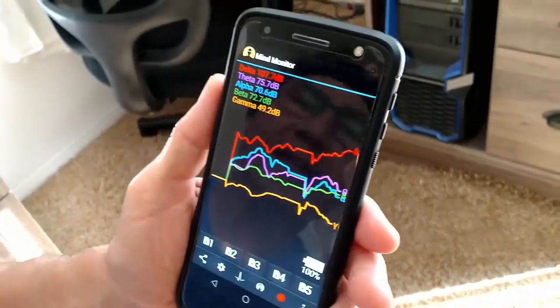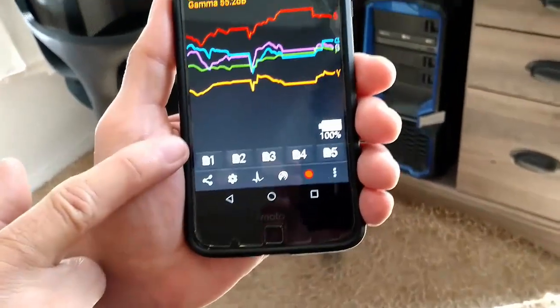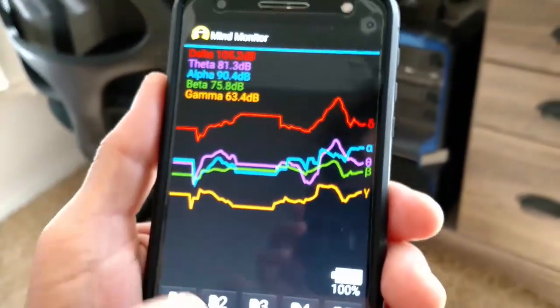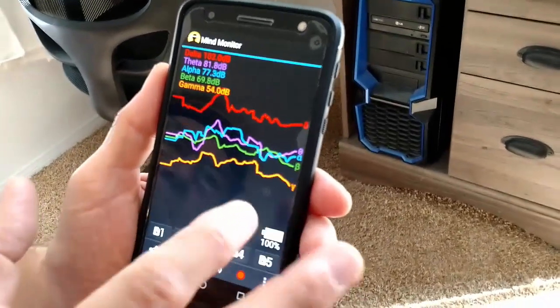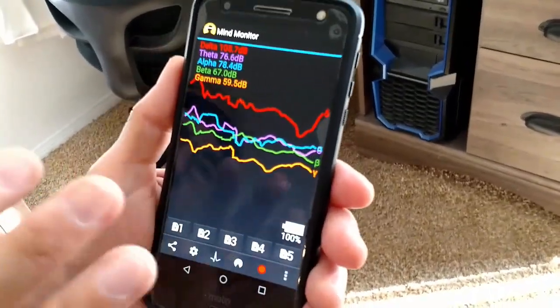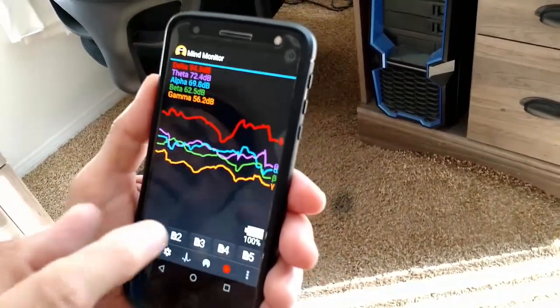The reason it does that is that it has to make sure that you've got contact on all 5 points before it can get started up and present you with a reliable reading. So anytime that comes on, that's telling you that during that period of time, the readings it's taking aren't particularly reliable.